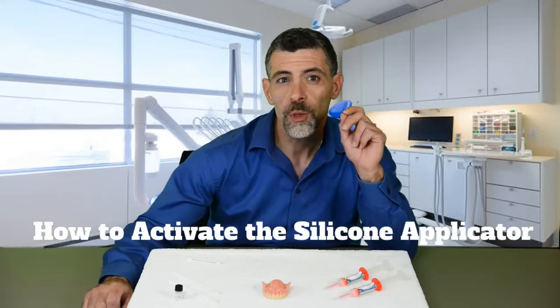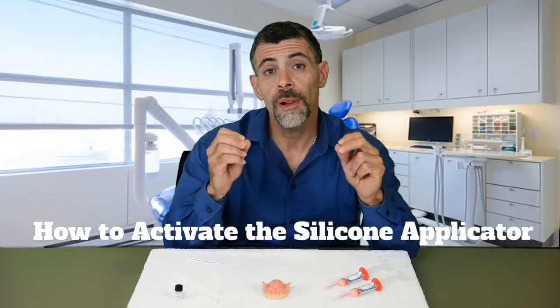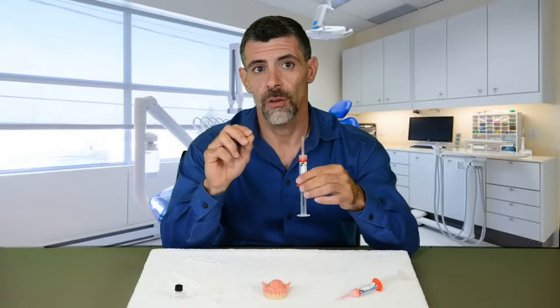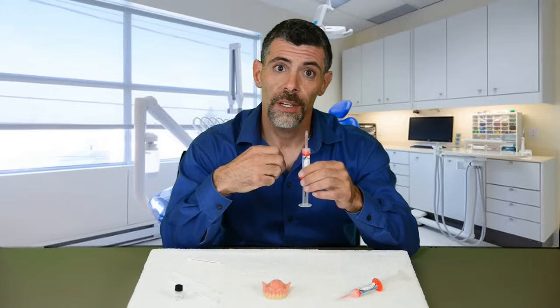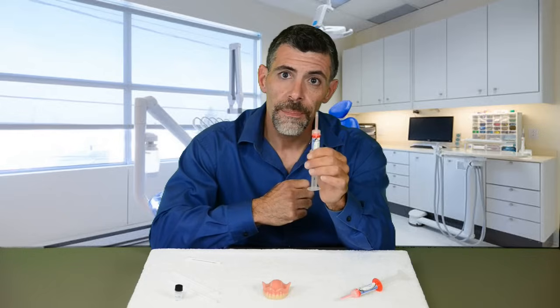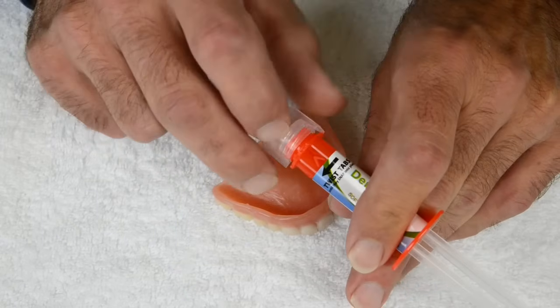Now it's time to apply the silicone. I'm going to first explain how we are going to apply it, and then we will do it together. But first, let's talk about the correct way to activate the silicone. Hold the barrel of the applicator firmly in one hand, and with the other hand you will tighten or twist the clear wing tabs in the direction of the black arrow until you hear and feel it snap into place.